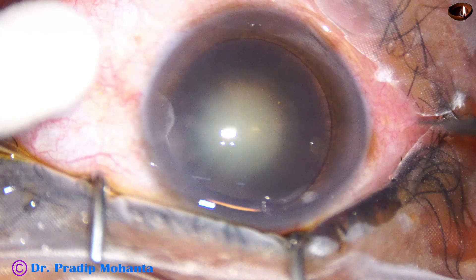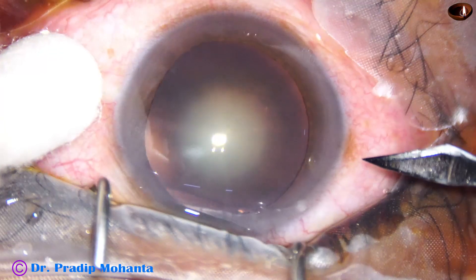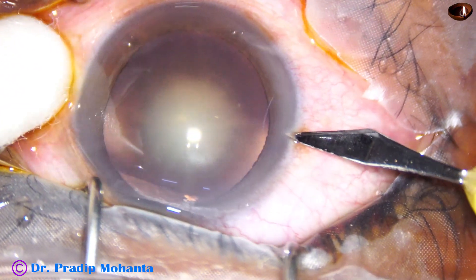Every surgeon has his own style of doing a surgery. This surgery is being done by my colleague Dr. Dibindu Shah.